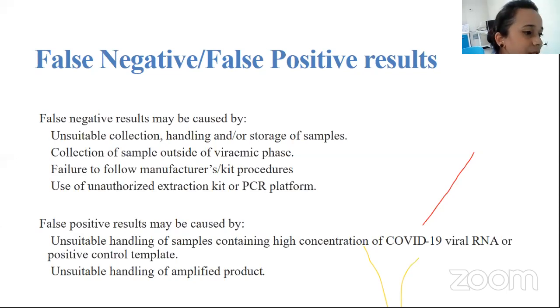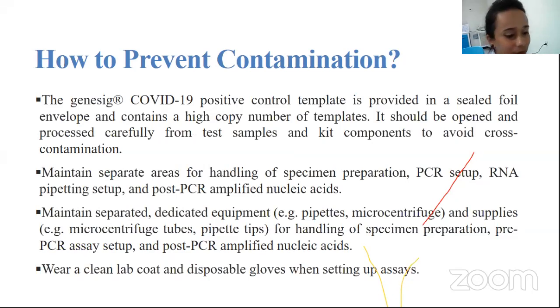And then one of the reasons for false positive results can be unsuitable handling of amplified product, that is the PCR product as well. So you have to be careful while storing it and everything. So there are chances of contamination during this whole process. So how can we prevent any kind of contamination during PCR, especially during diagnostics?